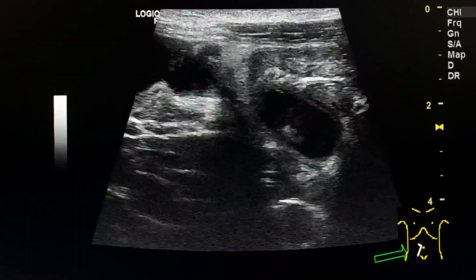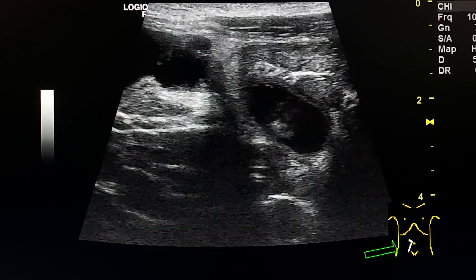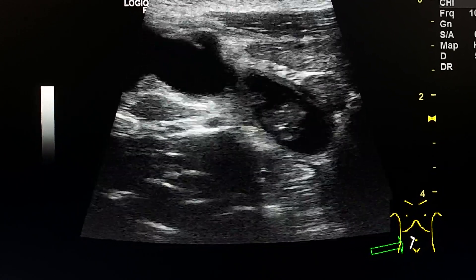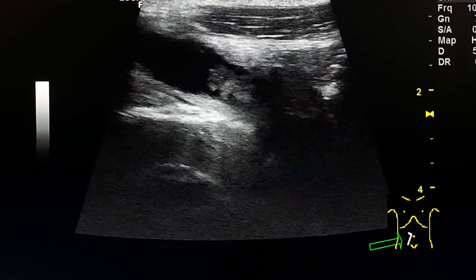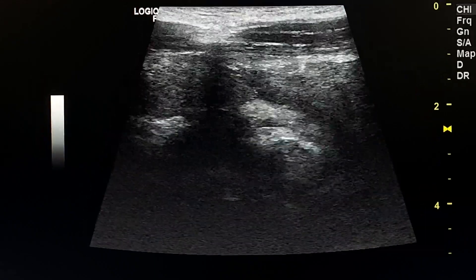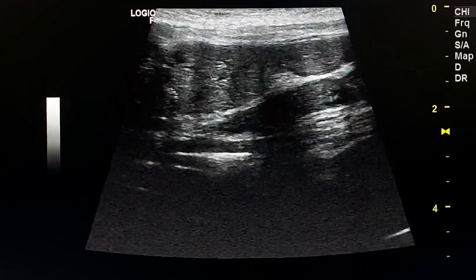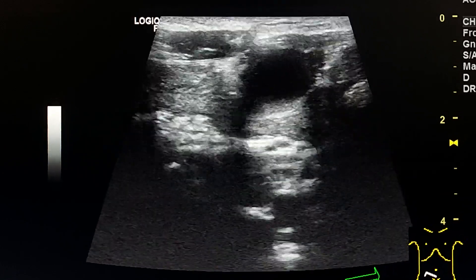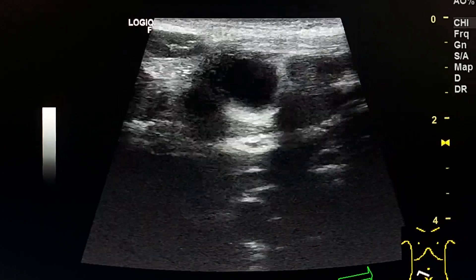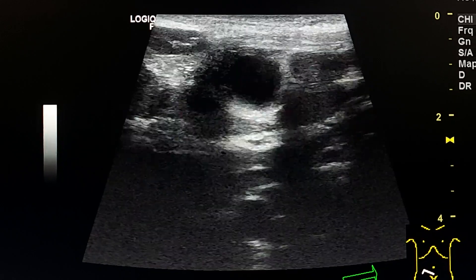This is a long longitudinal section of the diverticulum at this area. This is a transverse section of the diverticulum.